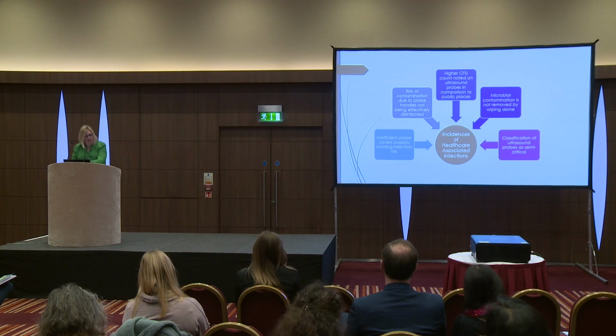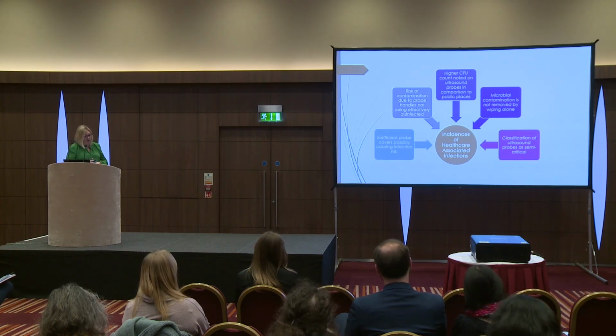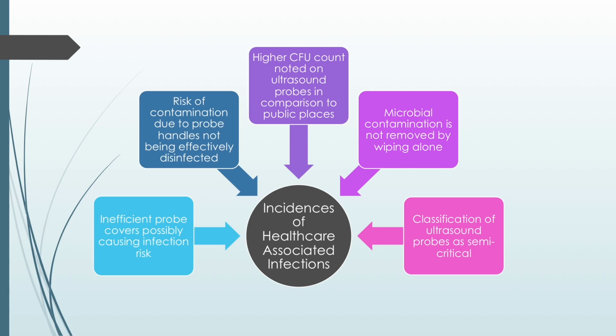Coombs noted that disinfectants that are used tend to have limited virucidal efficacy against HPV type 16 and 18, and both of these problems combined could result in the transmission of HPV. So these comments are from studies concerned with transmission of healthcare-associated infections to our patients and question the current low-level disinfection methods as opposed to using an automated high-level disinfection.